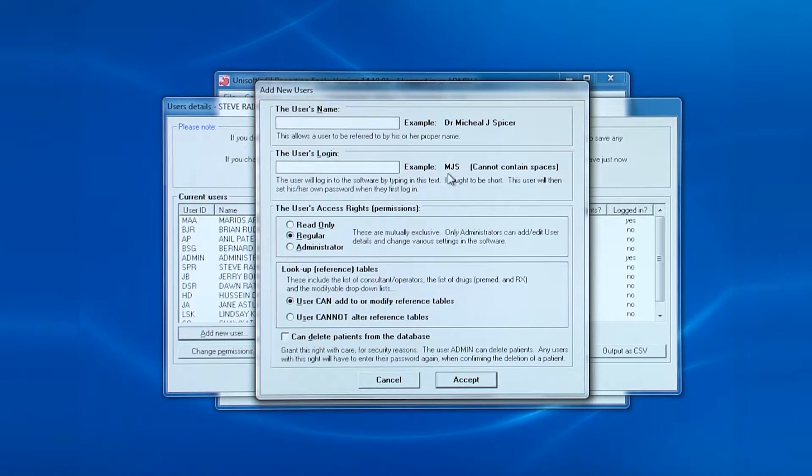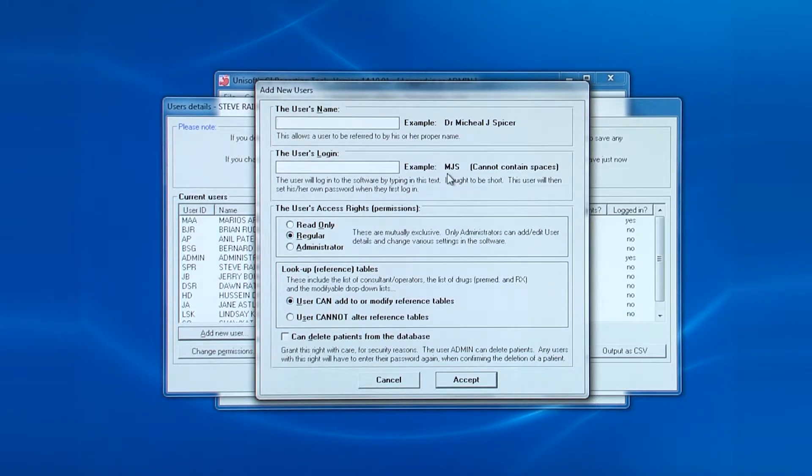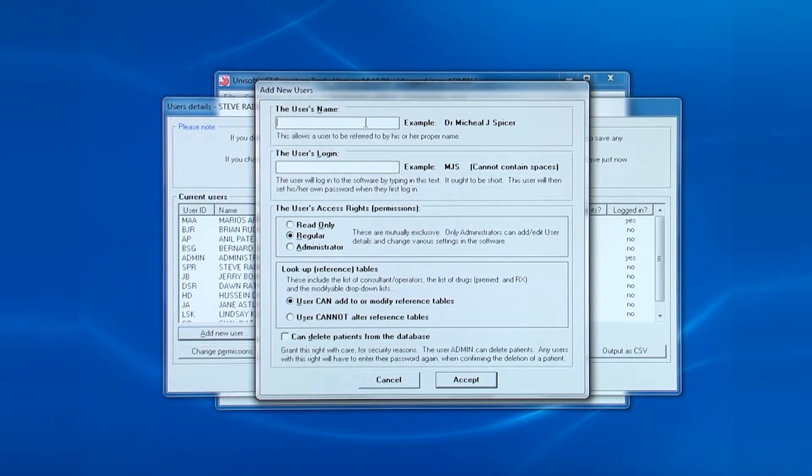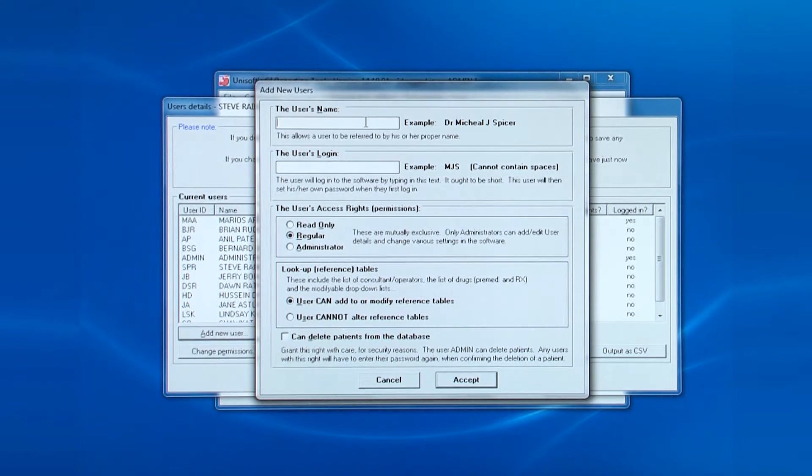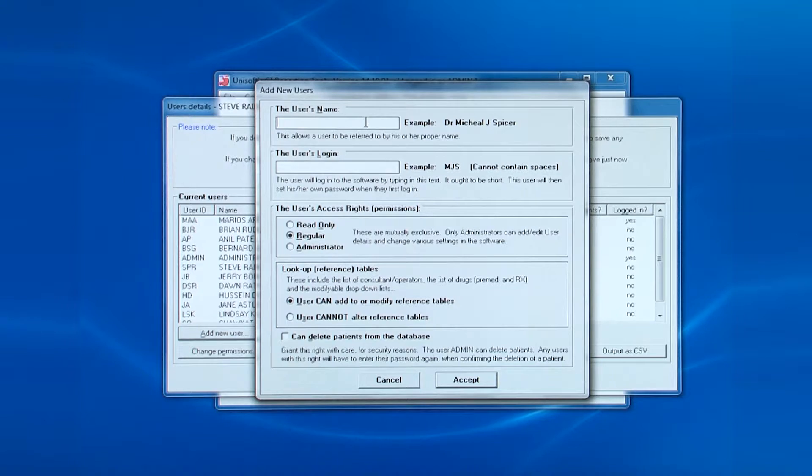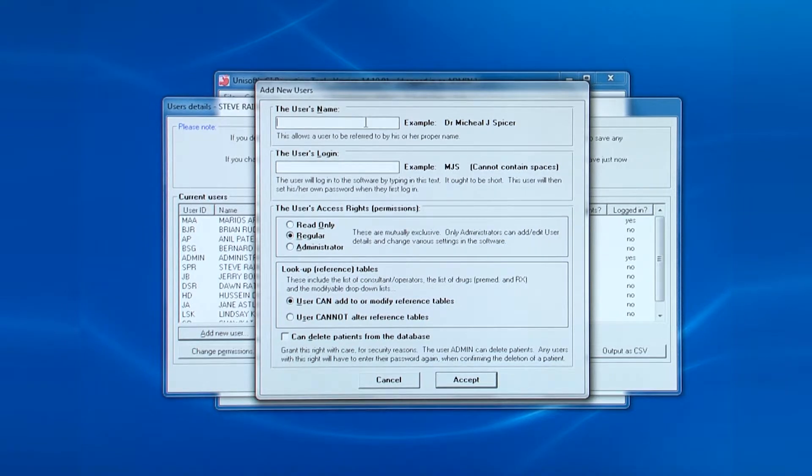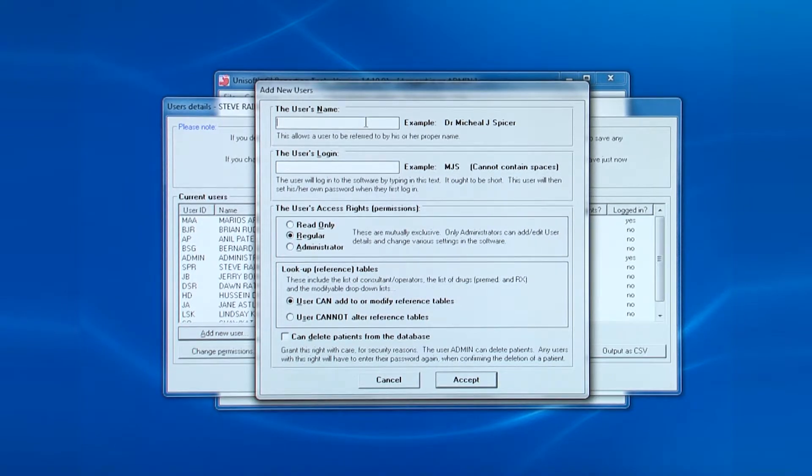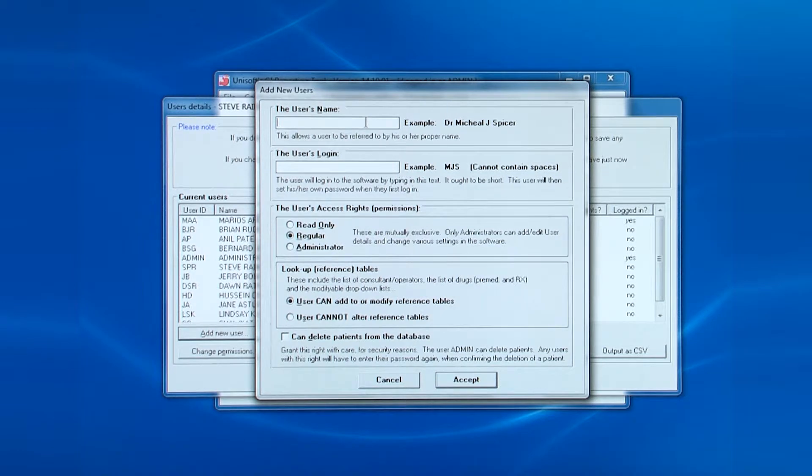Note that there are sufficient examples to explain what needs to be entered. And also note there is nothing about their password in this box. Only when this user logs in for the first time will they create their own password. So the first field is the user's name.